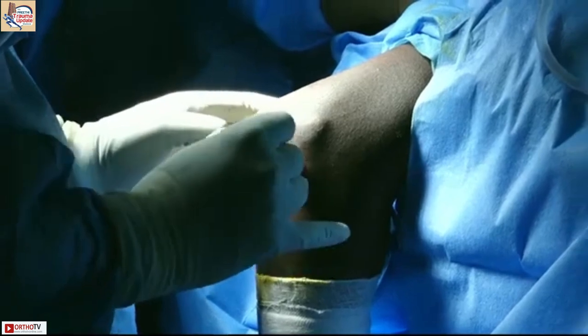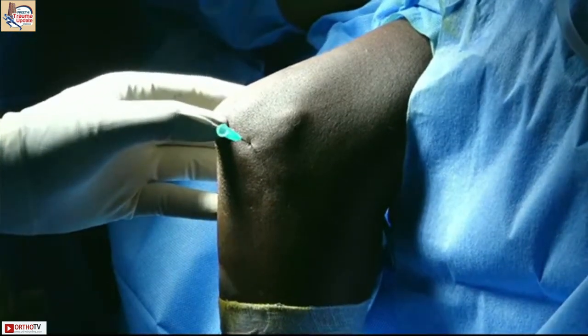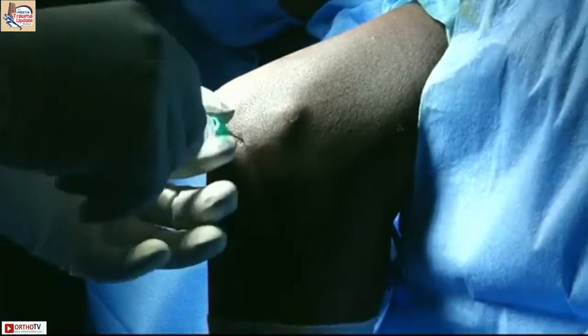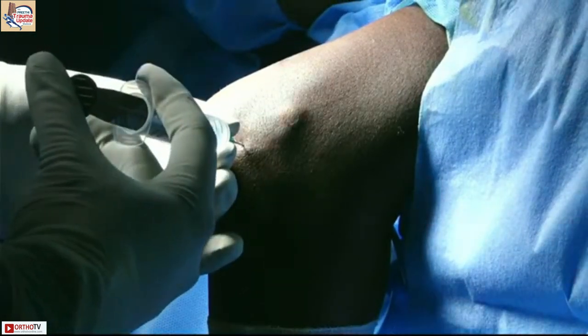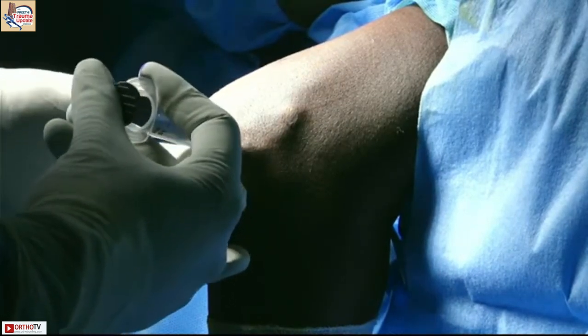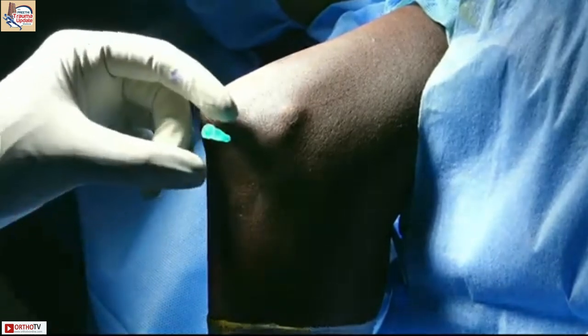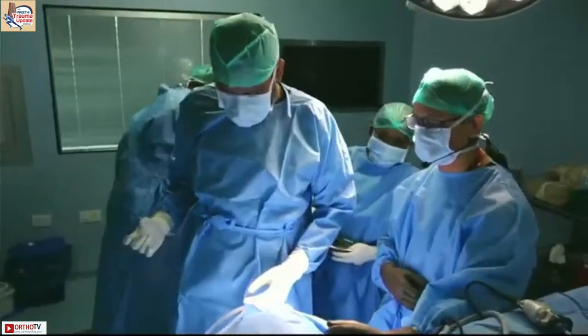You can normally feel the soft spot. And you put a needle in it, and it goes between the radial head and the capitellum, and then you insufflate the joint with saline. And normally, when you do that, it goes easily without any pressure, and the fluid comes back. Can you see that? Yeah. Which means it's in the joint.